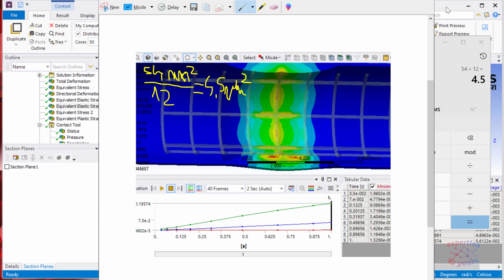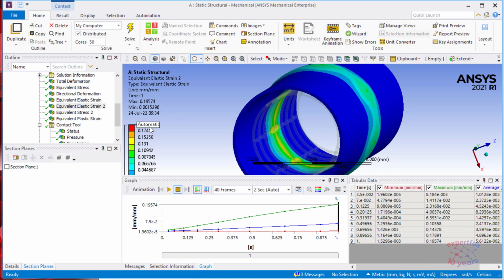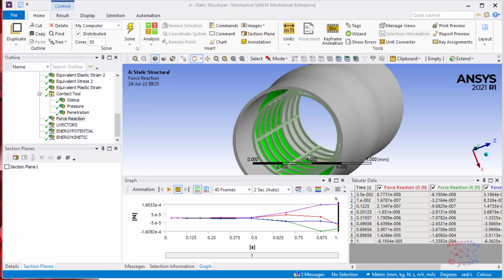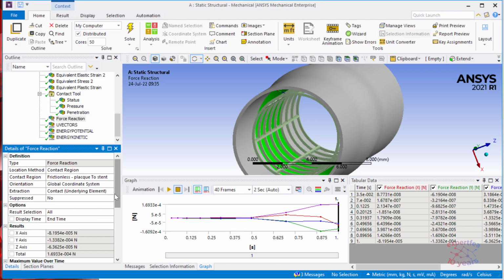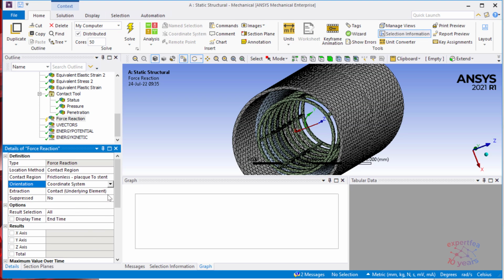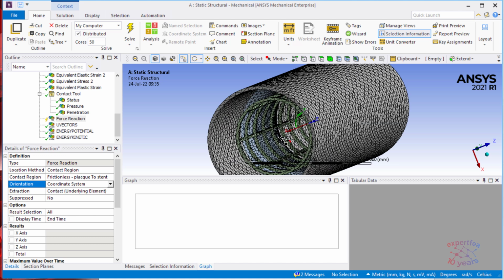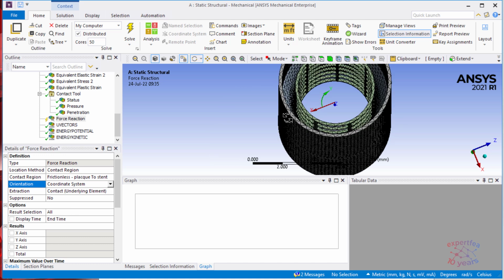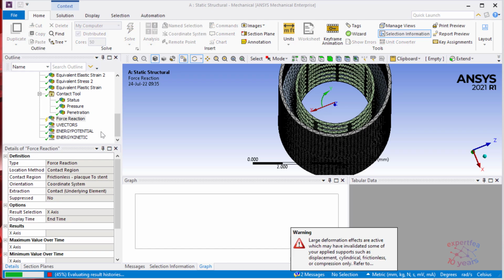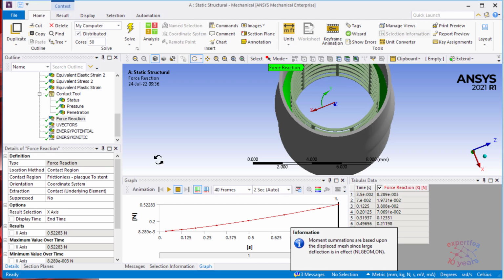So now you remember, let's go to the force reaction. What I forgot here is the fact that it shouldn't be on the global coordinate system, it should be with the local coordinate system. Result selection, let's choose only the x-axis to have only, let's say, the radial component. Right click, evaluate all results. Now we have a proper force reaction.